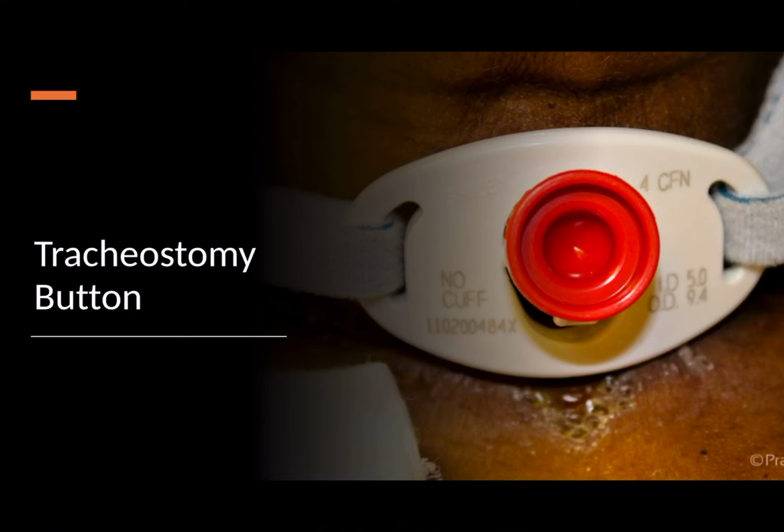The tracheostomy button is something that we don't really see that often, but you will see some people doing it. Other people call it capping off the tracheostomy. In this country, in the UK, we generally tend to use a red one. And what it does is it completely occludes the tracheostomy. Now, obviously, this cannot be done in patients who have a cuff that's up, because then there's no air going in, there's no air coming out.